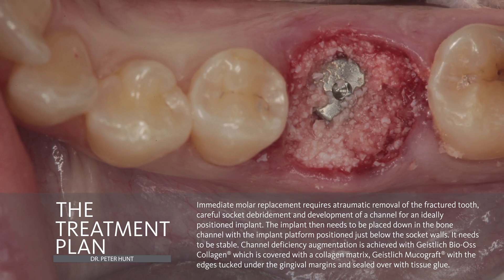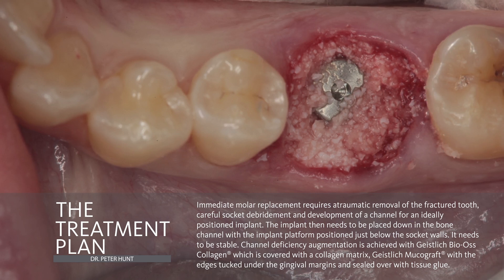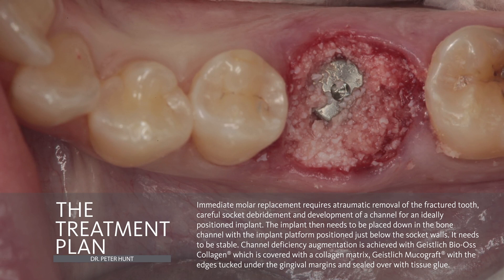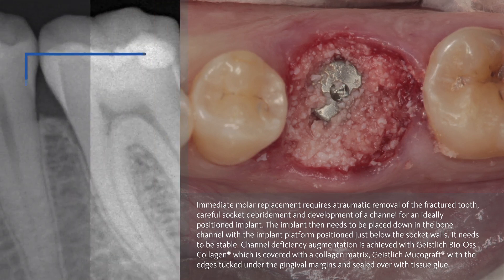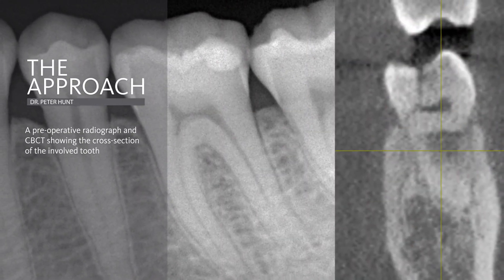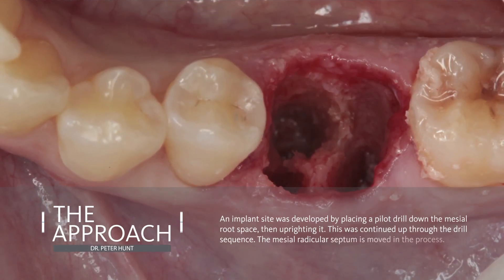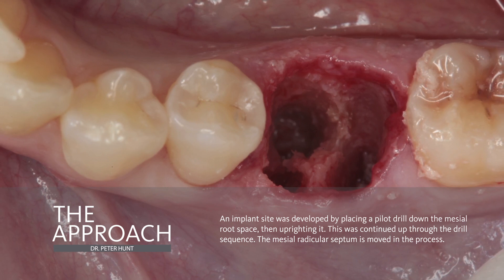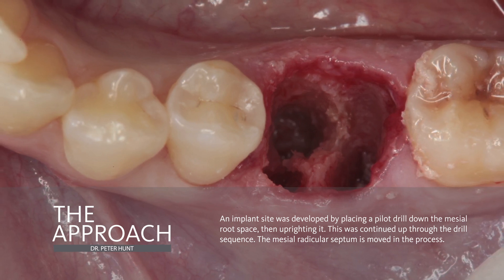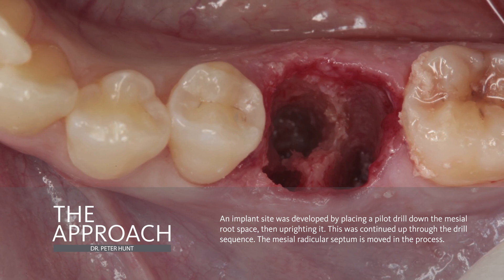The approach is simple enough. We need a careful atraumatic removal of the fracture. We're going to be placing an implant into the socket and that requires changing the position of the septum. So we have a whole process which we need to follow the steps very carefully. So let's start with the original situation. Here you see the fracture that she presents with. And so she has chosen to go with the implant route. The first key to this is a clean atraumatic extraction. You can see that I've diverted the septum by placing the initial pilot drill down to the mesial root space, and I am uprighting that. And we find that almost invariably the septum will move and become formed as you see here.